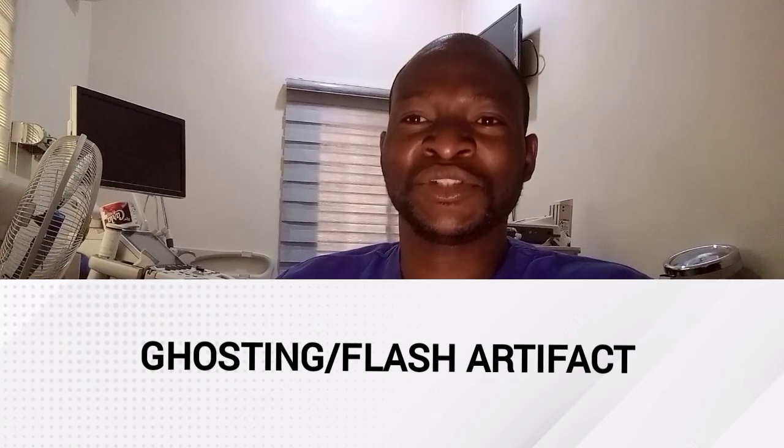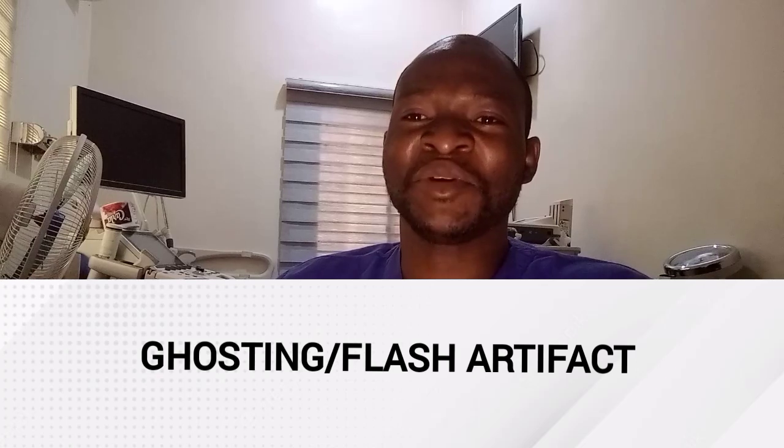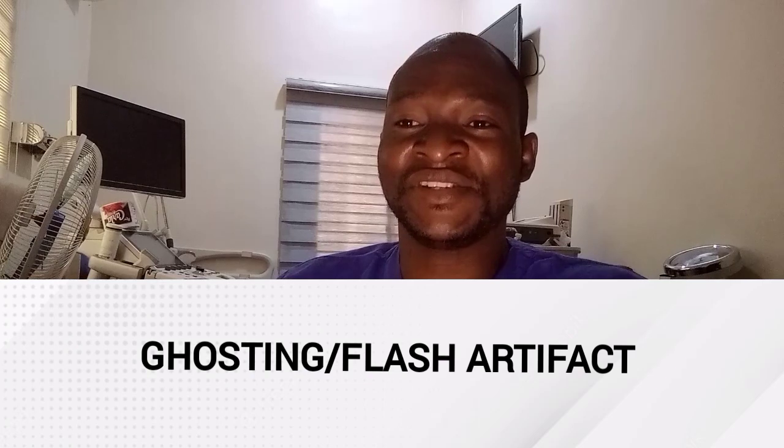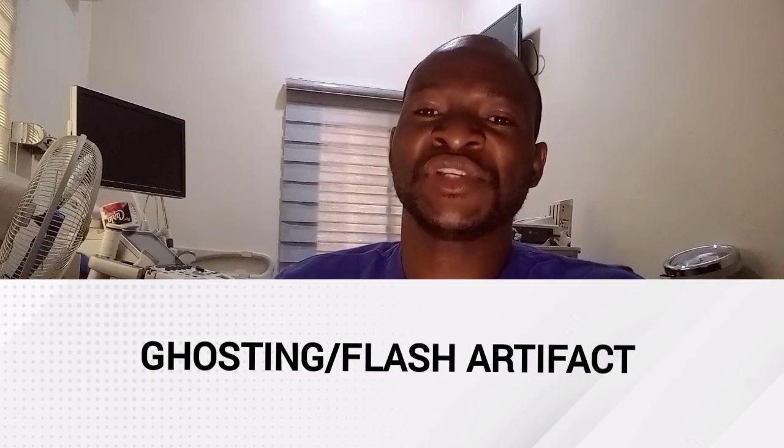Now, soft tissue should be displayed as grayscale echoes, not in color. So color may be written over the structure because of their movement. Decreasing the color gain below a threshold level for the display of color vis-a-vis display of grayscale pixels, or adjusting the wall filter, can help reduce the flash artifact.